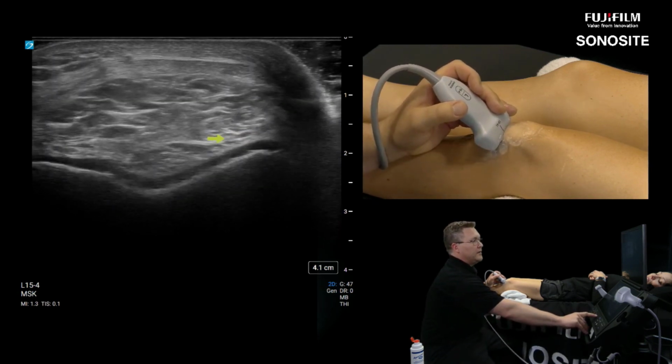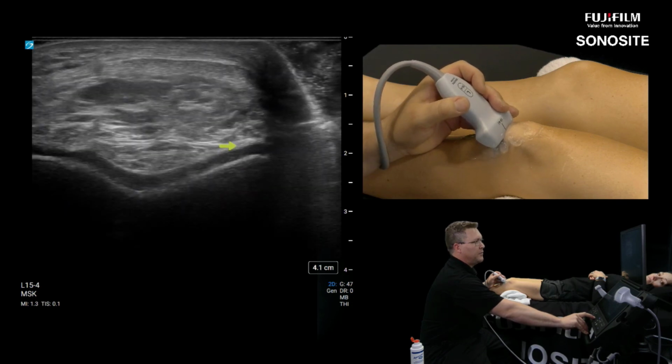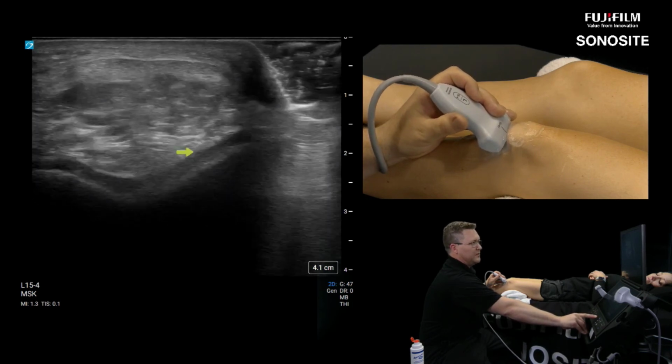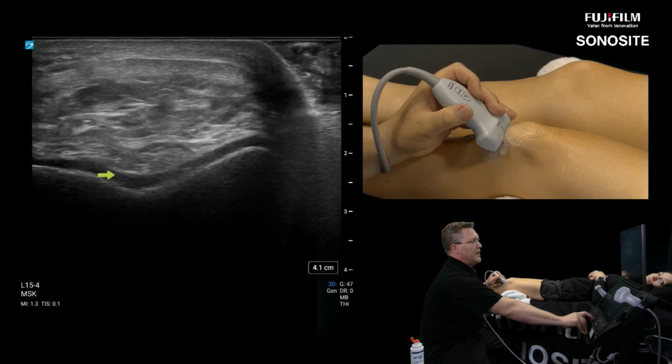That bone you're hitting is the cartilage, and we want to avoid scuffing the cartilage if we can, because you're probably going to inject some sort of corticosteroid. And corticosteroid over a cartilage scuff is not good for the cartilage. So let's avoid that and look at the confidence we can have with ultrasound.